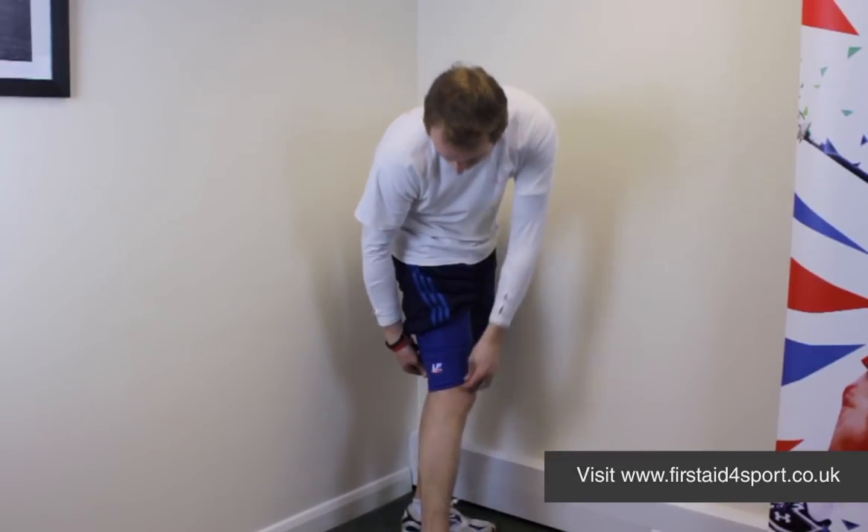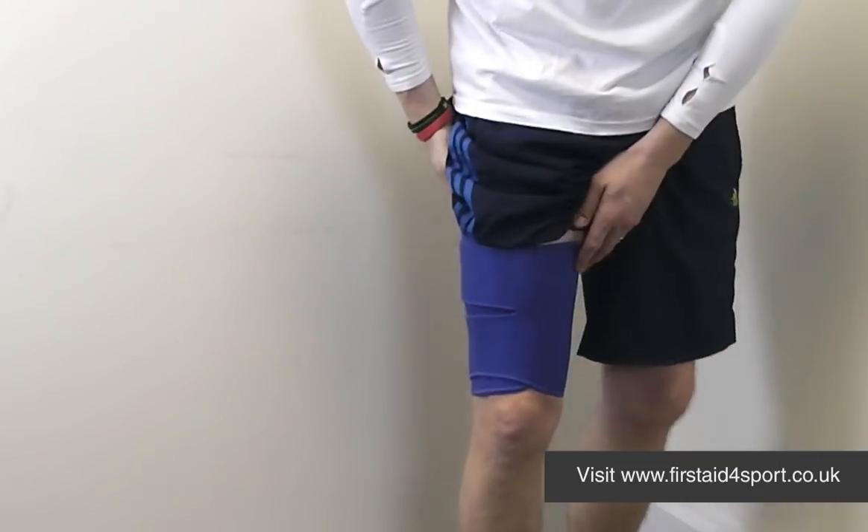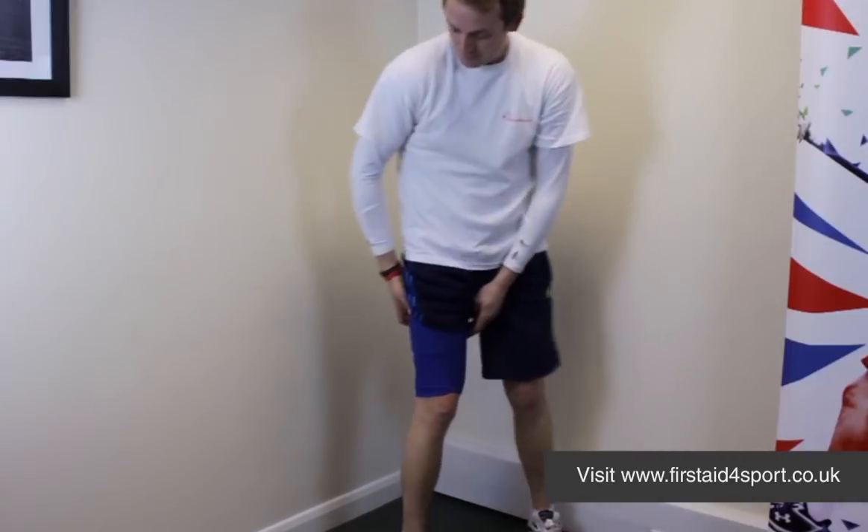If you need to adjust it, it's really simple to do — pull it off, spin it round. And so that's the LP Thigh Support.